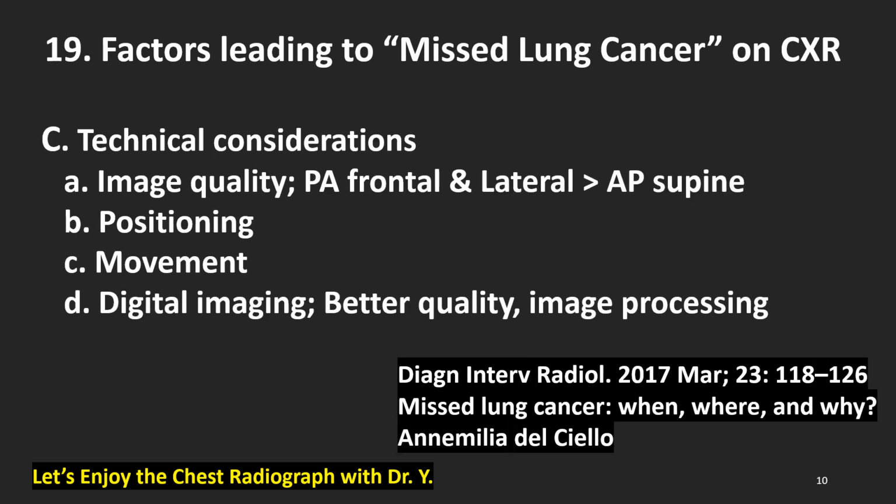C. Technical considerations. A. Image quality. This is important. PA frontal and lateral view is much better than AP film, supine film. B. Patient positioning. C. Patient movement. D. This is the digital imaging period. So imaging is much better than the previous period, and we can even process the image on our own monitor desk.